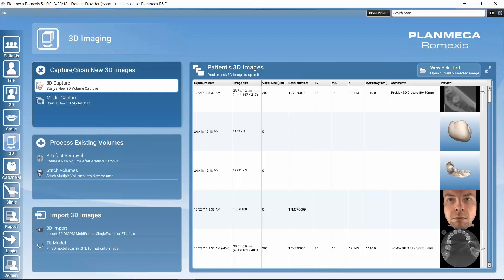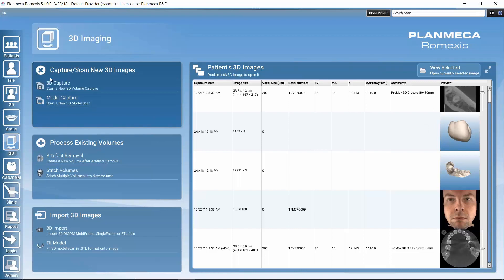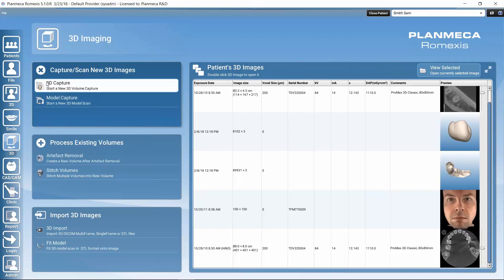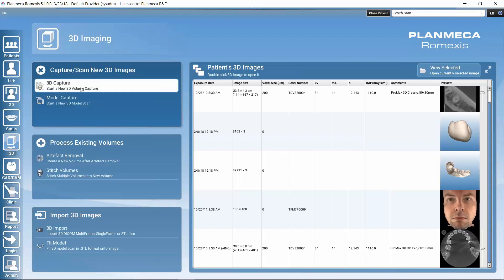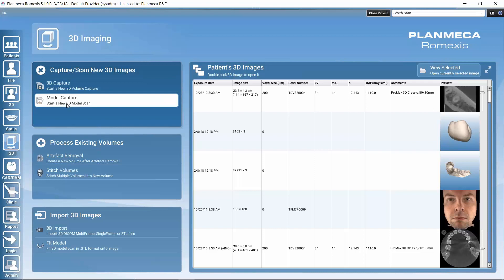We could also naturally capture new images using the 3D capture function. If we have a 3D imaging device configured, we could capture new images for this patient. Or if we have a model scan function in our 3D imaging unit, we can make a digital model of the patient's physical impression or dental model with the model capture function. So with this we could capture new data.